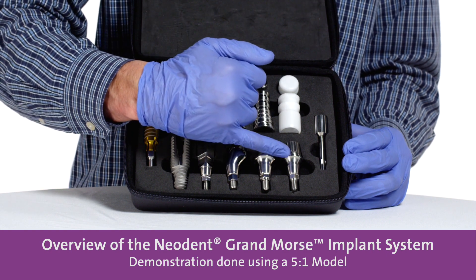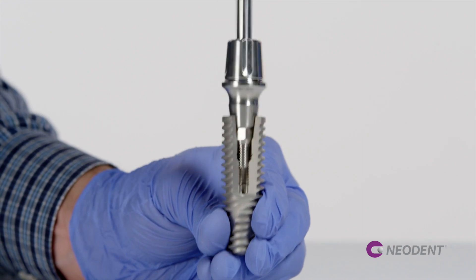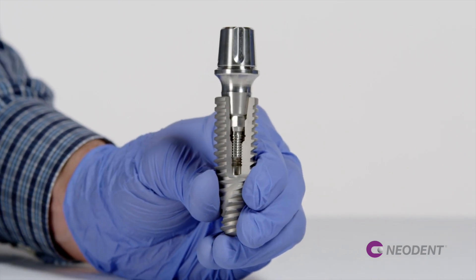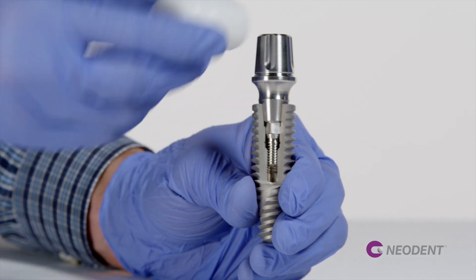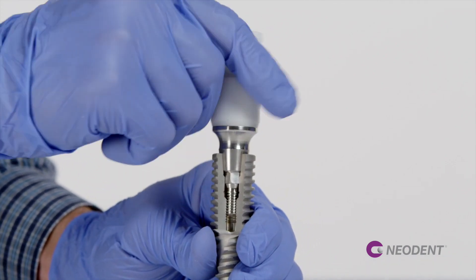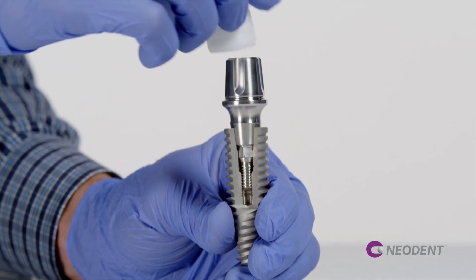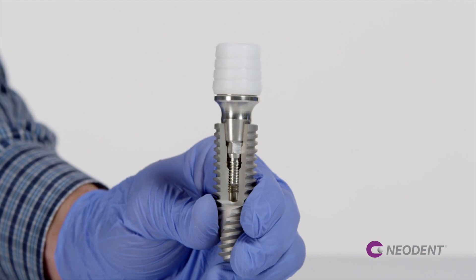Here is the universal abutment to do cement retain or screwmentable retain, and the recommended torque is 20 newtons per centimeter with the same neo driver. Once the abutment is placed, we are able to use a snap-on closed tray, and also we have the prefab plastic or acrylic cap that can be used to make a provisional restoration chairside or in the lab as well.